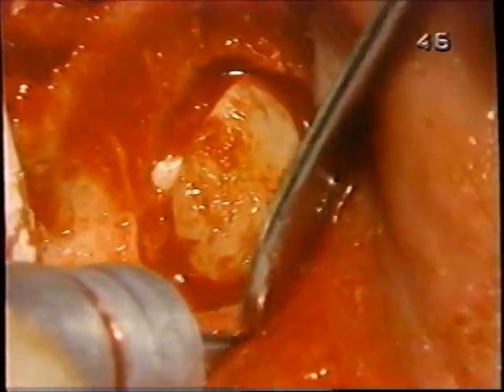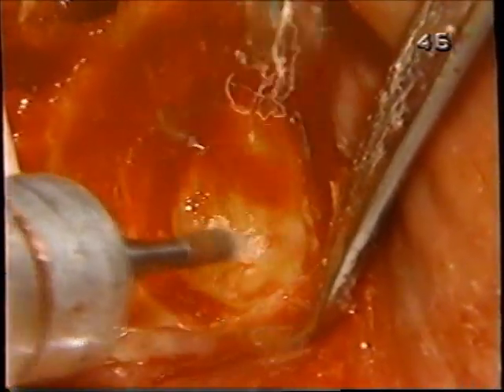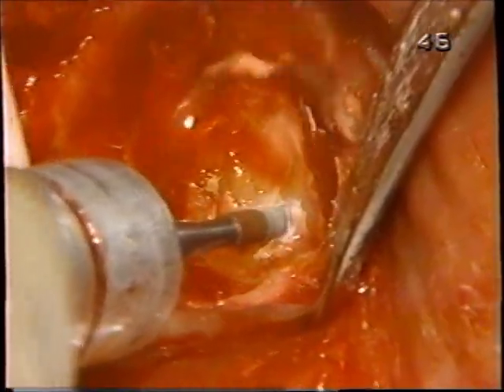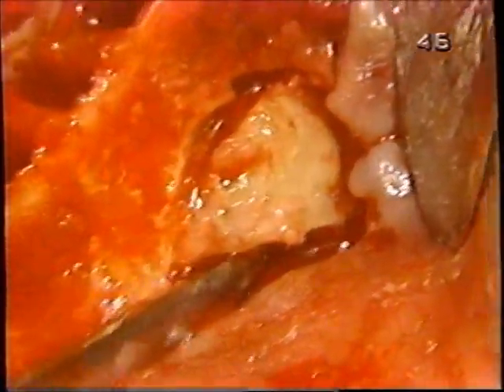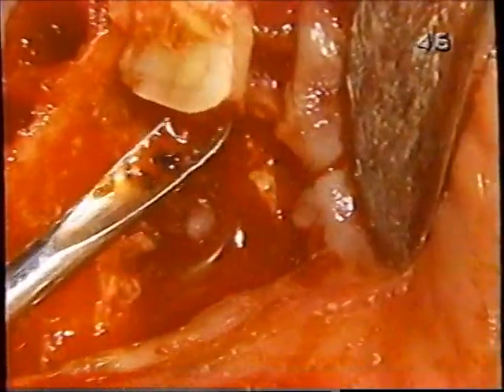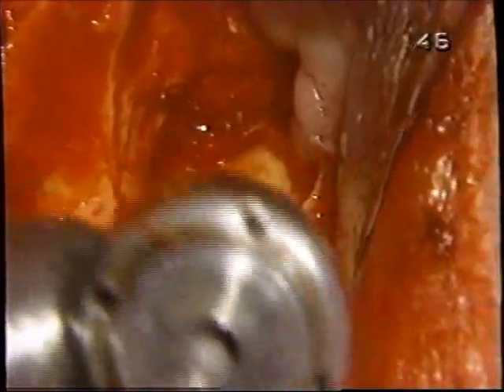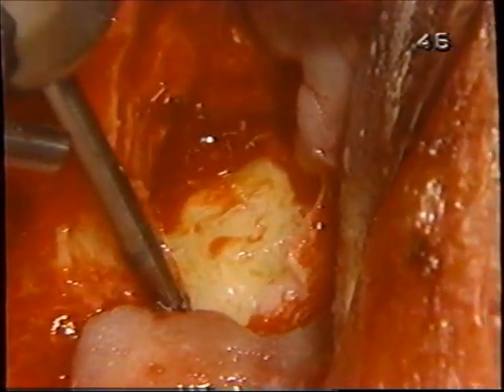So we're going to section it right across there. We'll keep a handle on it here. So we've removed the crown. We just looked at the x-ray to confirm the angulation of the root, which is to the right and down.